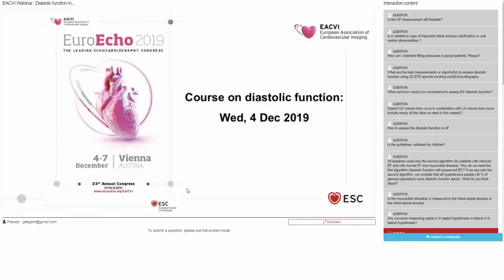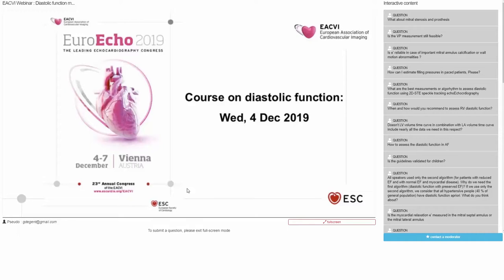I think the discussion about the site of E prime is also important. And you've mentioned you can stick with one, but again, probably useful to highlight that in some specific scenarios we need to be careful, like wall motion abnormalities, of course, and pericardial constriction. There we need to again apply reasoning and try to see what works, maybe an average, or maybe you go for the lateral, or you compare both. That's important from a practical standpoint.